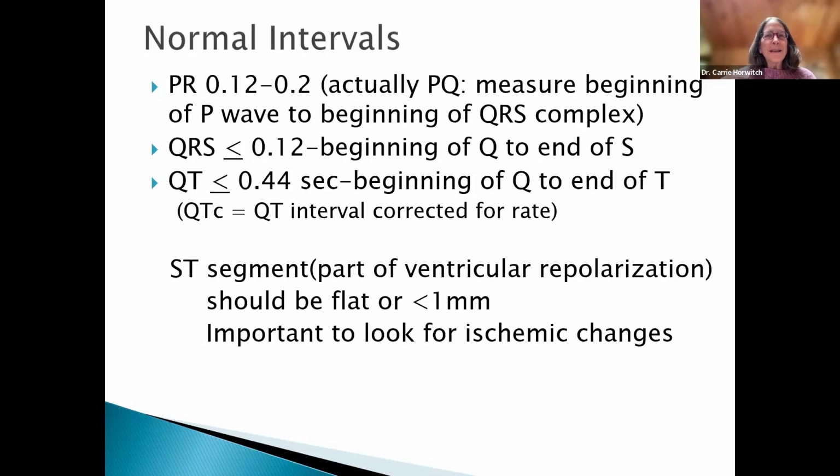In terms of segment elevation or depression, that's your ST typically, and it should either be flat or maybe less than 1 little box. But if it's more than that, then that is considered positive ST elevation or depression, depending on which. And then same thing with inversions. Inversion just means normally the P wave and the T wave are up, except in one lead. But if it's depressed, that could mean that there's some underlying issue.